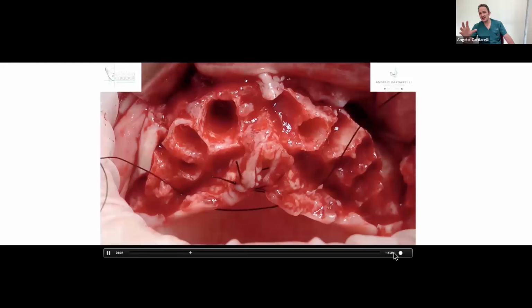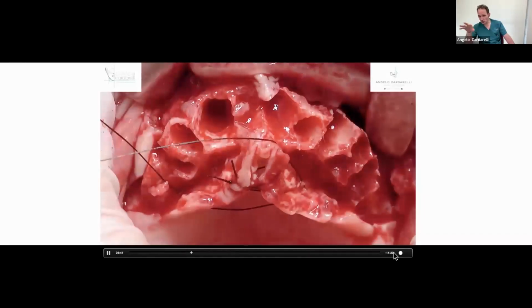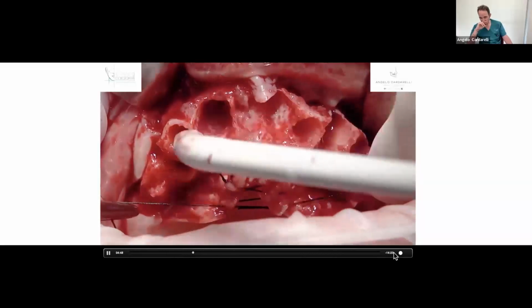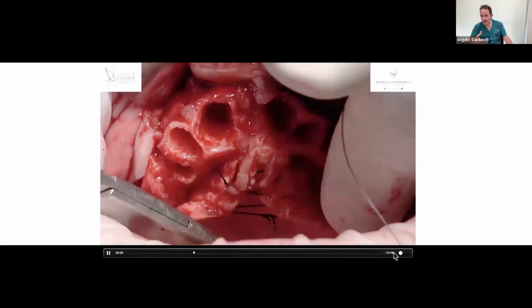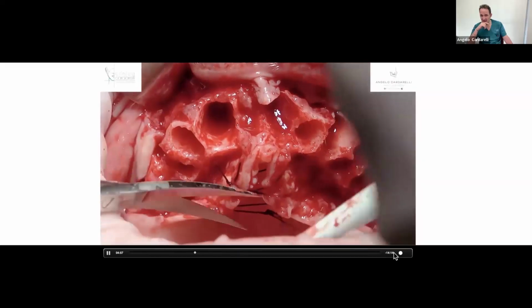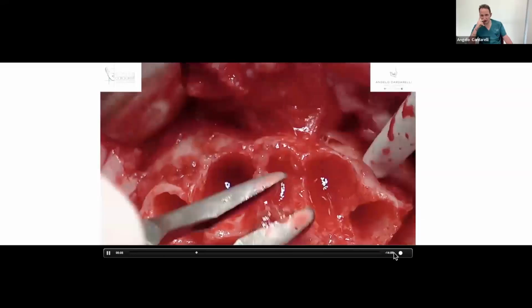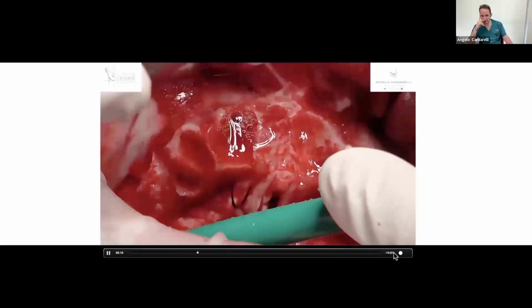So now the surgical view is much better, but we need to complete this procedure, removing the bone, performing the bone reduction to place the implant at the same level. From the prosthetic point of view, it is mandatory to make the ostectomy, okay? We need to remove the residual part of the infected tissue. We need to clean everything, okay?